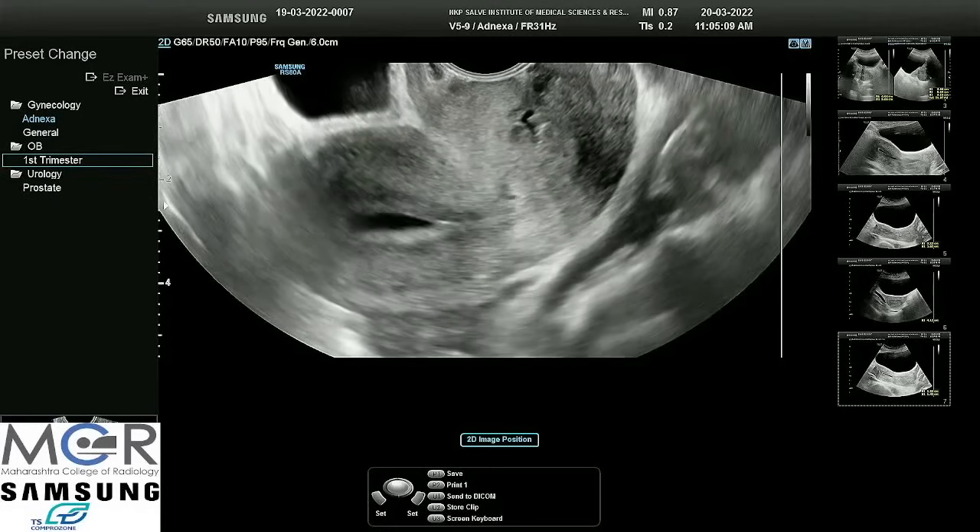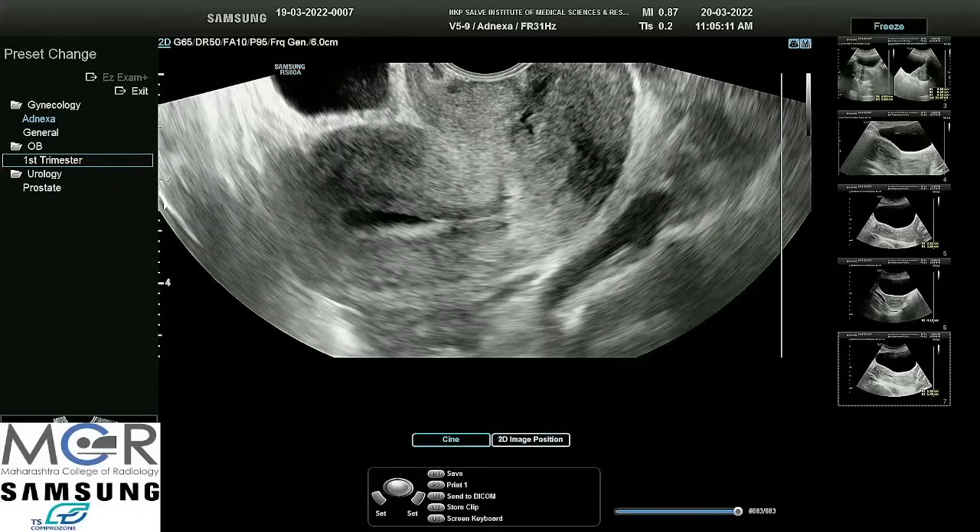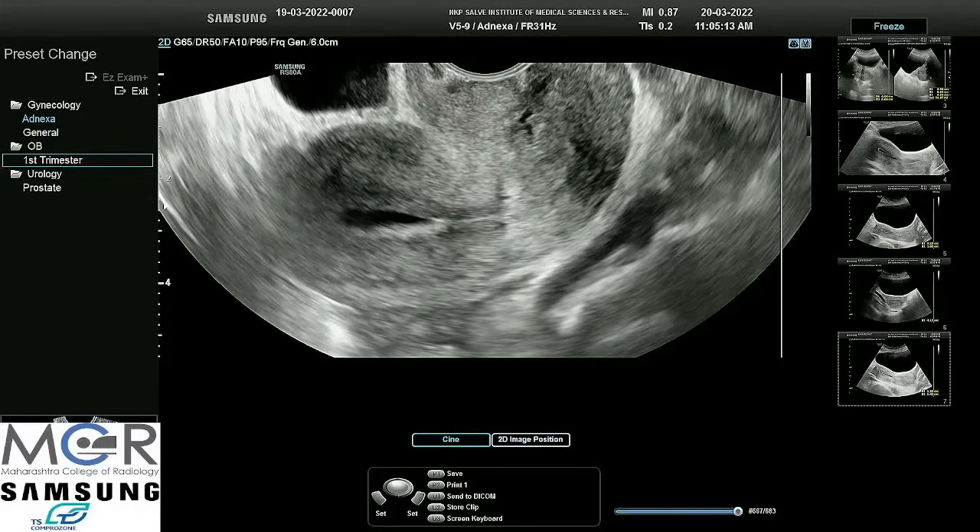In transvaginal we can appreciate the endomyometrial junction much better than from above. When there is any case of adenomyosis, this interface is lost. While taking measurements, we should take measurement from this end to this end — we should not include the halo.